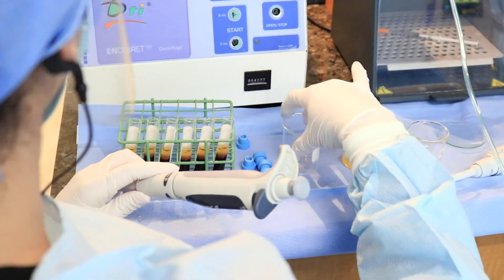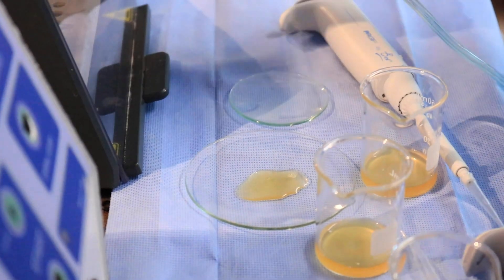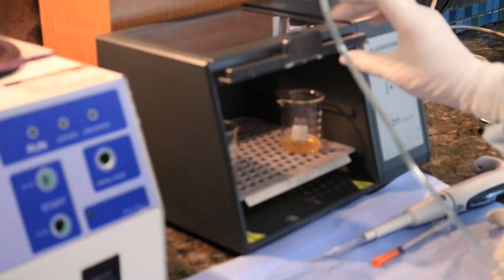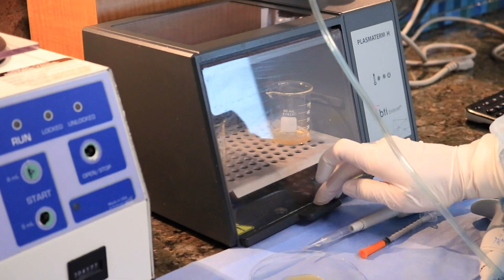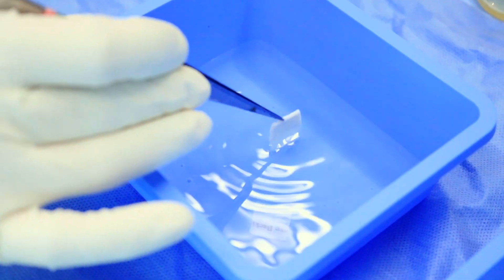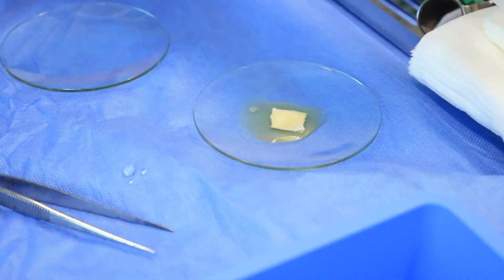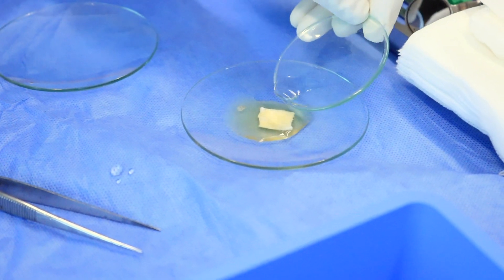It is these protein markers which signal to the regenerative cells and trigger their activity. Using the plasma transfer device, fraction one and two are then separated into labeled collection tubes. Immediately before implant placement, the selected implant's entire surface will be moistened with PRGF. The liquid will also be injected into the osteotomy.